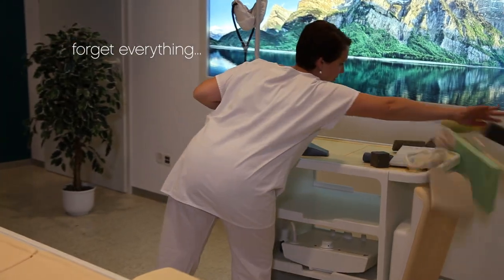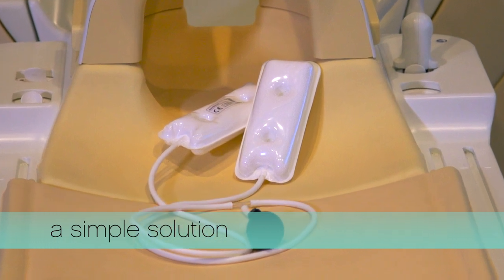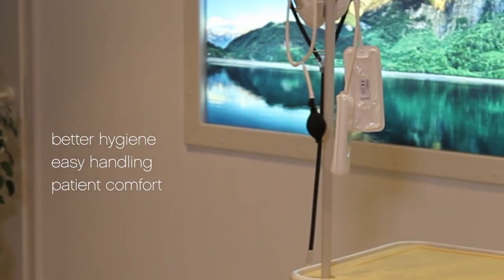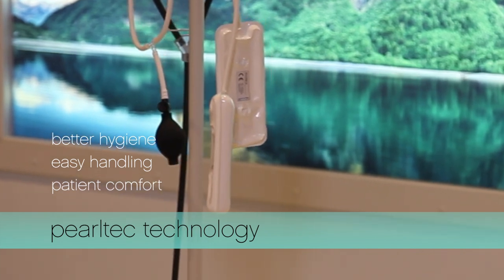Forget everything and take a look at the new PearlTech product family that offers you one tool that solves everything. Better hygiene, easy handling, and increased patient comfort are combined in one easy-to-use tool. The new PearlTech patient positioning devices enhance the workflow efficiency of your department.